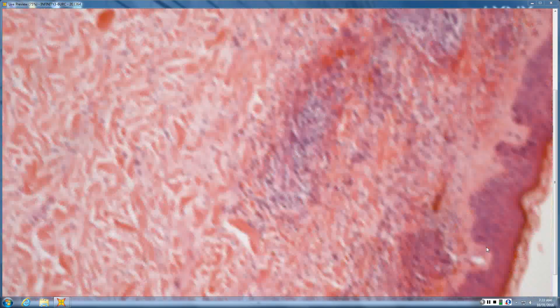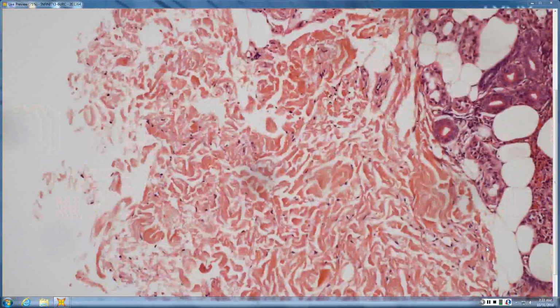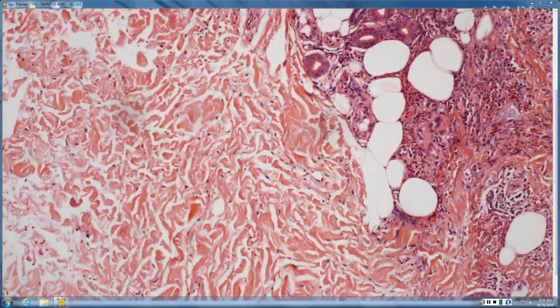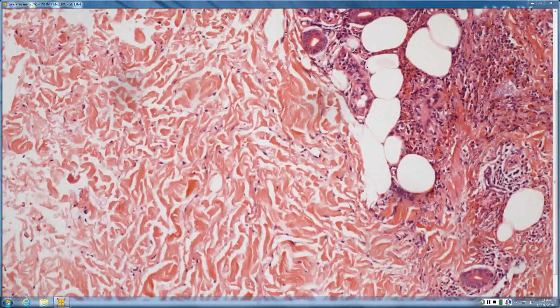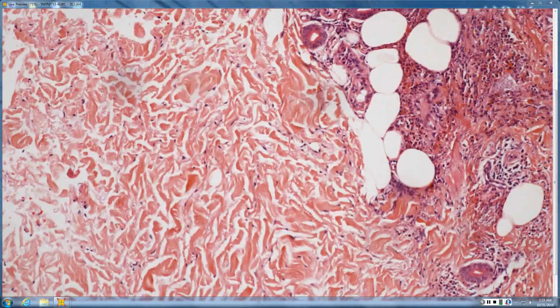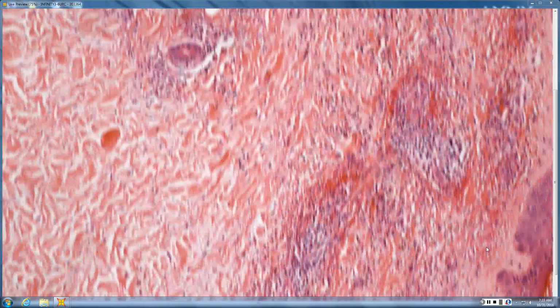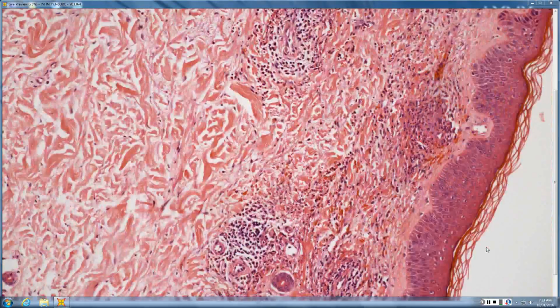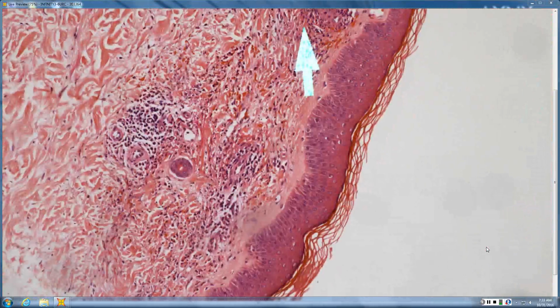So, Shane, what do you see here? Superficial and, well, maybe superficial and mid. Okay. Mid is perforators. That's no man's land. So it doesn't help you big 5, little 5. Those are just perforating vessels, either one. Definitely some neutrophils and some karyorrhexis. Neutrophils, karyorrhexis, expansion of the vessel wall, fibrin, imagine that in this chapter. What are the odds? Okay. What are the odds of that? Exactly.